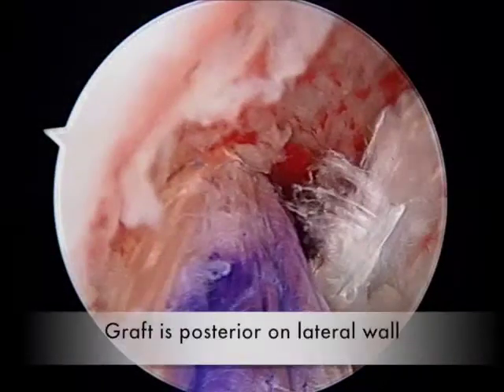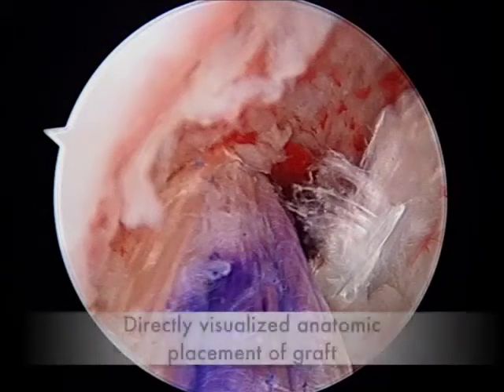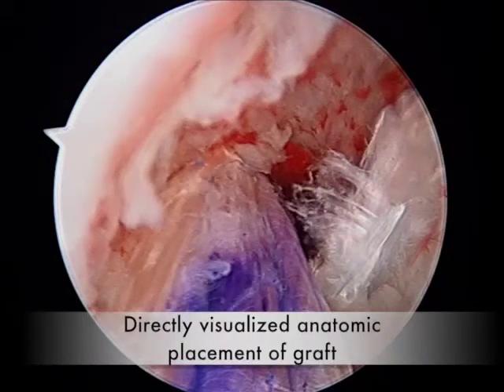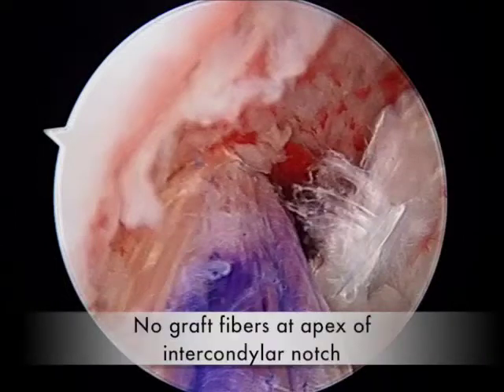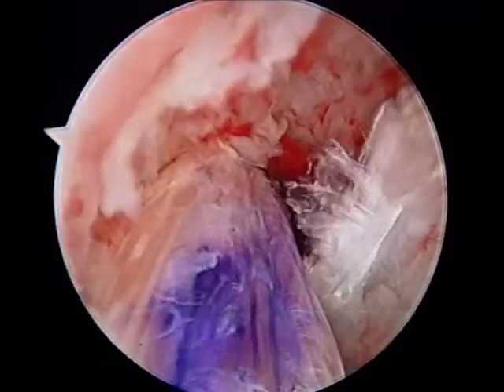So here we see that the graft is anatomically positioned on the lateral wall of the femur, posteriorly and distal. We can see this directly. There is no PCL impingement, and there is no graft reaching towards the superior position of the intercondylar notch.